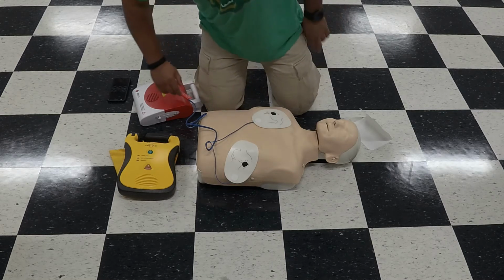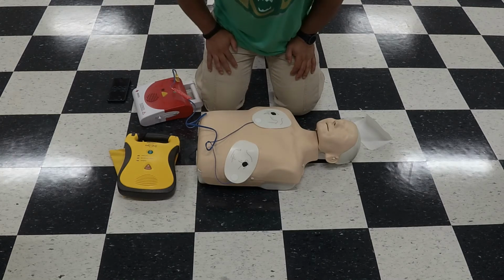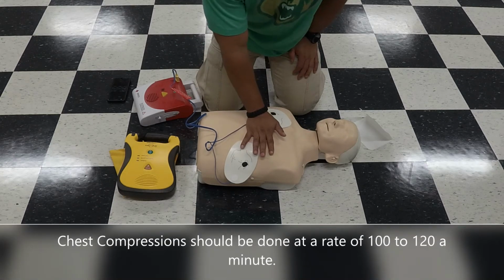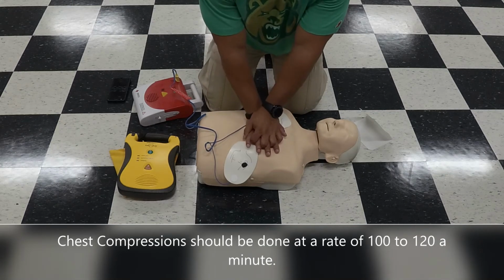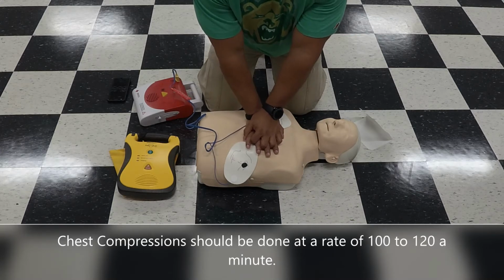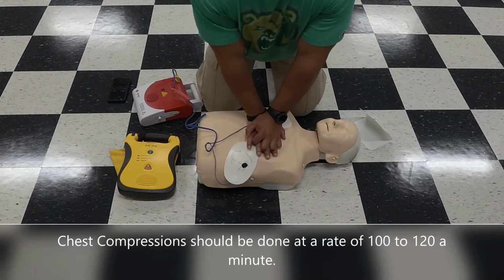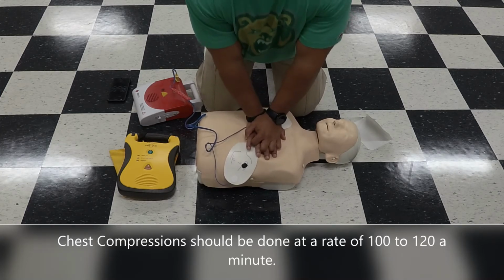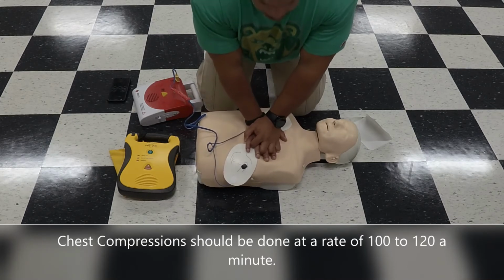Now, after the shock has been administered, it's safe to do compressions. Typically, EMS will be about 5 minutes away, so you should be able to do compressions. I would advise you to cycle in between two compressors, two different people doing compressions. Remember, the compression should go approximately 2 inches deep.